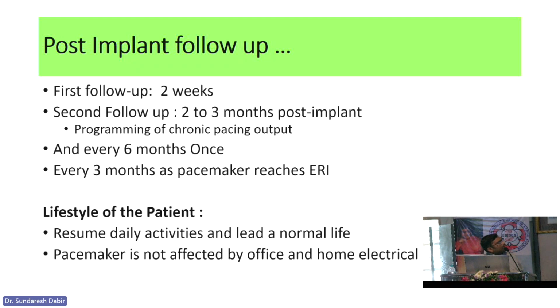In that condition, let's say I got the minimum voltage required in the ventricular pacing is 1 volt. I can confidently keep it at a 2.5 safety margin voltage. That is how you need to analyze yourself and give the patient safety. And the most important thing is patient safety here, right? So it's all in our hands.